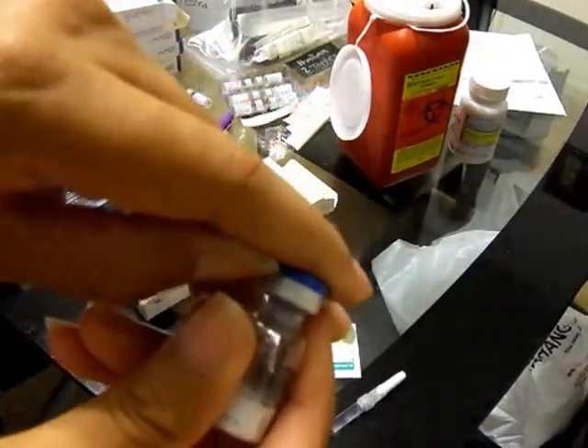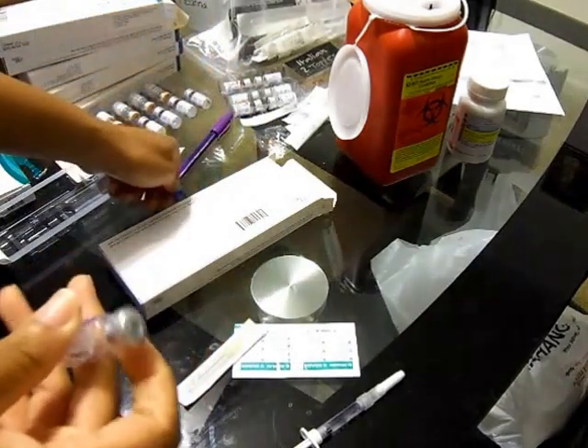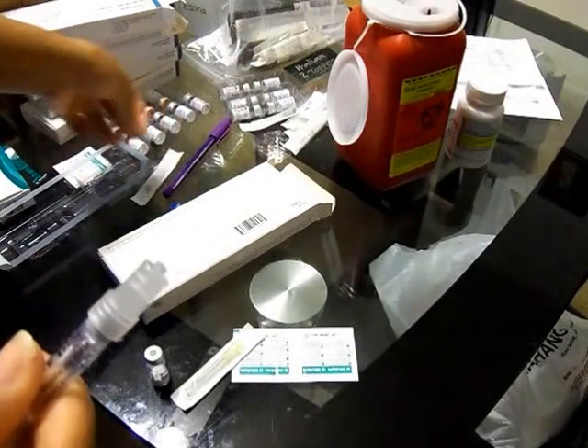To take it off, you take your nail and you pop it off. With this, you don't twist it off because it's not going to twist off — you have to rock it from side to side to get it off.